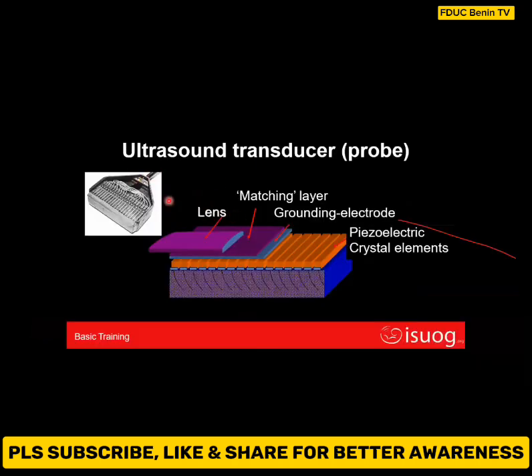And as I said, the major components of the ultrasound probe are the piezoelectric crystal elements. This is usually the most important part of the ultrasound probe. These elements send out sound waves and receive echoes. Because they are so important, they're covered with the ground electrode, the matching layer, and the lens. This is why, if the piezoelectric crystal is damaged, the probe becomes useless. That's why the probe must be handled with care: once there's damage in the piezoelectric crystal element, the probe has to be replaced.